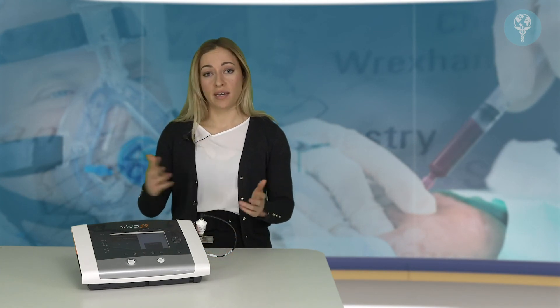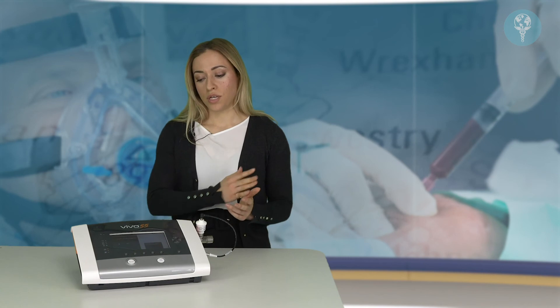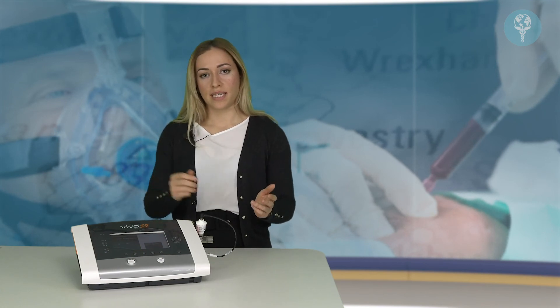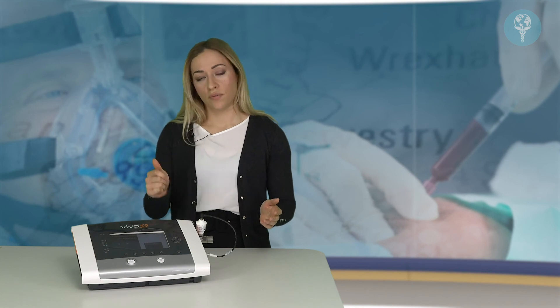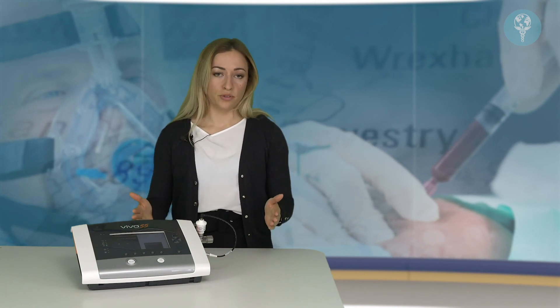One thing that's important to note when entraining oxygen through the Vivo 55 is that you should only be entraining oxygen while the device is actually running and ventilating. Make sure that you start the treatment first on the ventilator, then turn on your oxygen. When you want to stop treatment, turn off the oxygen before stopping treatment on the ventilator.